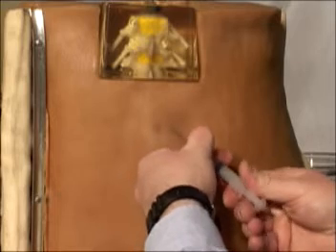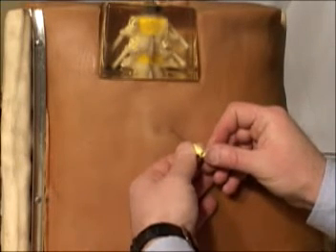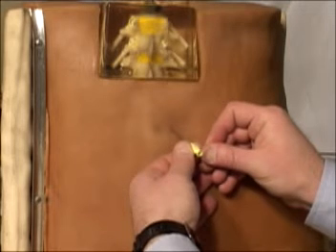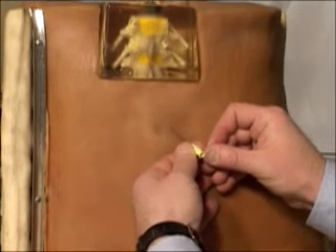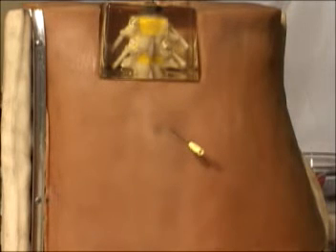We then remove the syringe body and continue with the insertion of the needle. The successful puncture of the dura is met with a distinct click felt through the needle by the practitioner. Spinal fluid immediately flows from the 22-gauge Quincke, indicating a successful dural puncture.